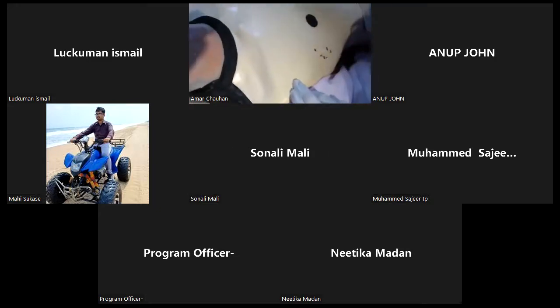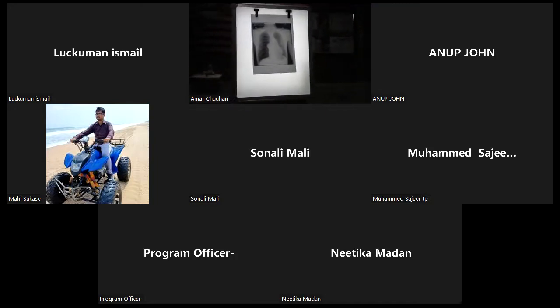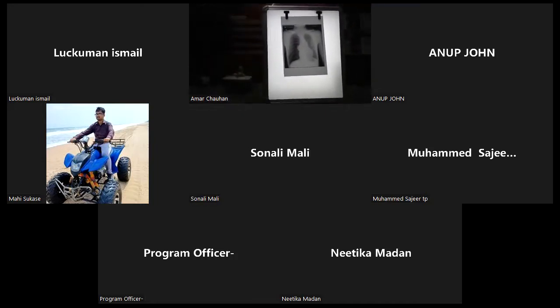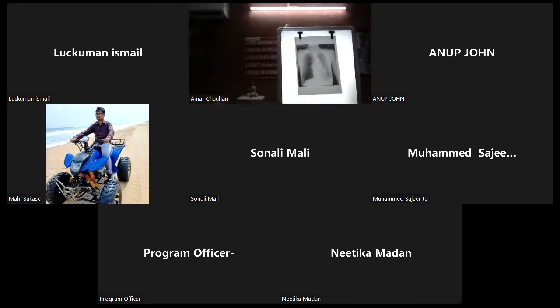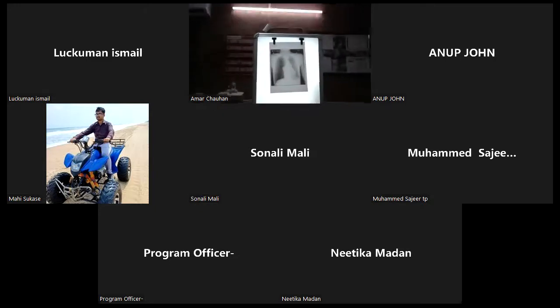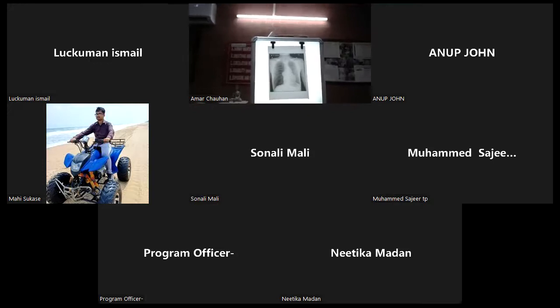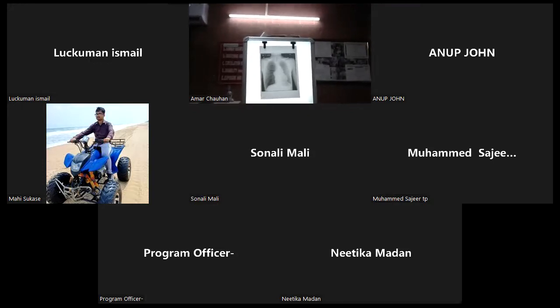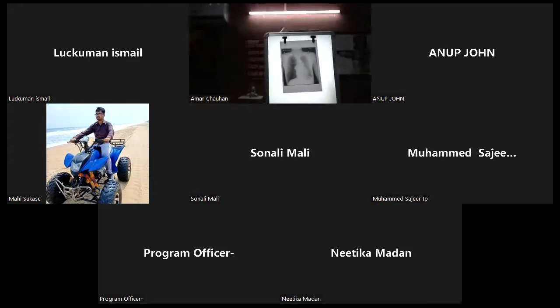So we did the X-ray, and you can see on the X-ray there is a right-sided pneumothorax, and we have this ultrasound simulator. If you have ultrasound facility, this patient has a condition where something needs to be done urgently.